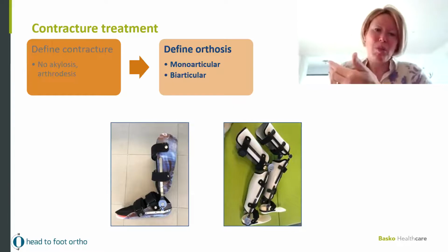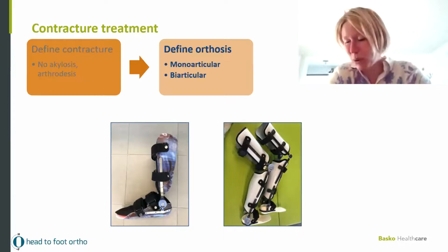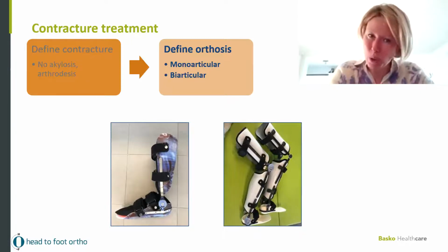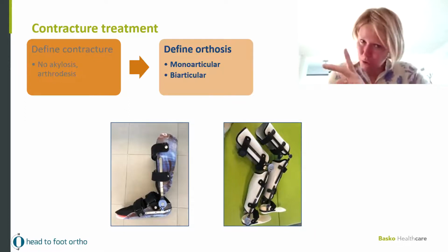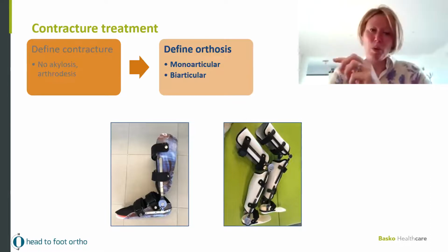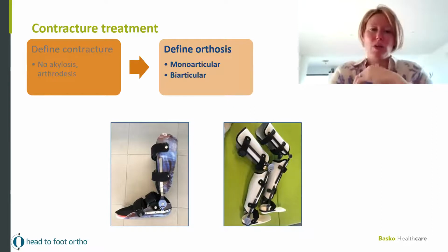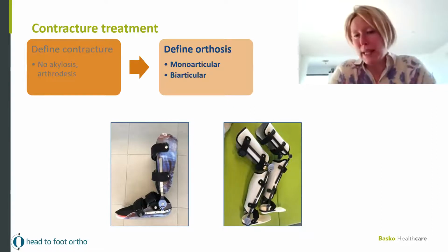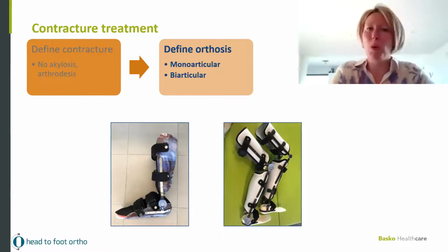During the day, while he was seated, he put the AFOs on with multimotion. Was that biomechanically wise, the perfect solution? No. But in 30 days, we had a person that stands into a standing table with just 1.5 centimeters of heel height. So did we achieve our goal? Yes, we did. And he accepted the orthoses. And I saw him later on and he walks right now.